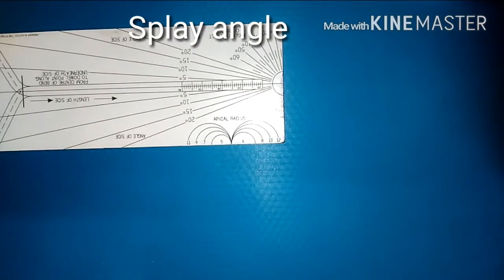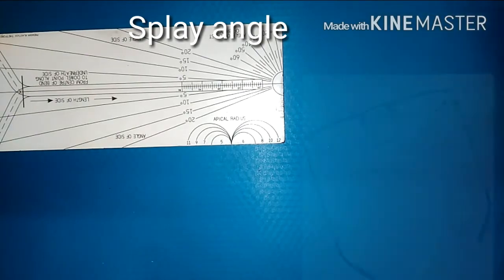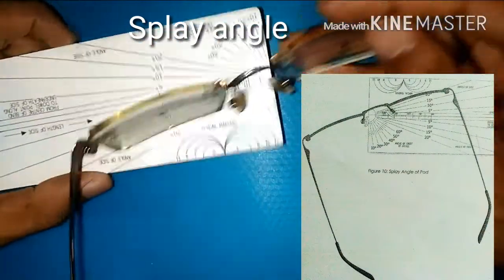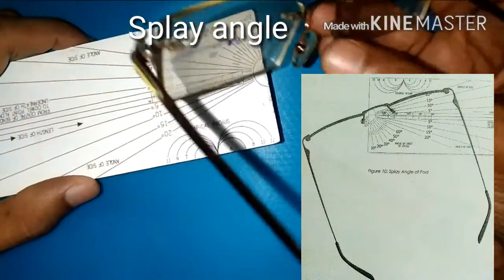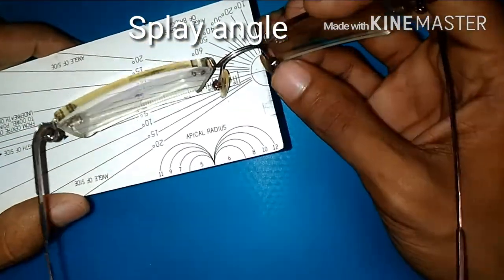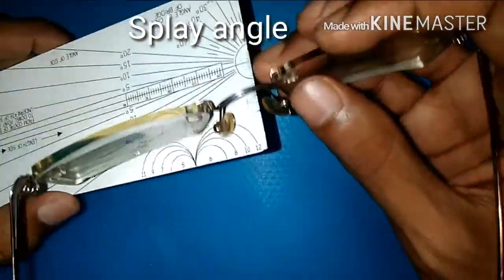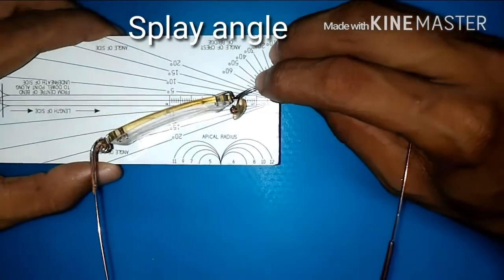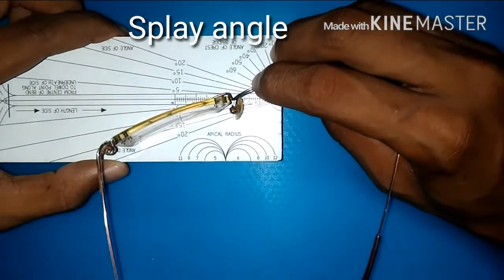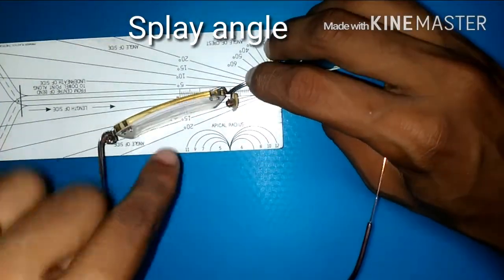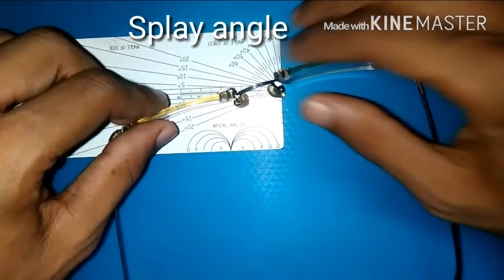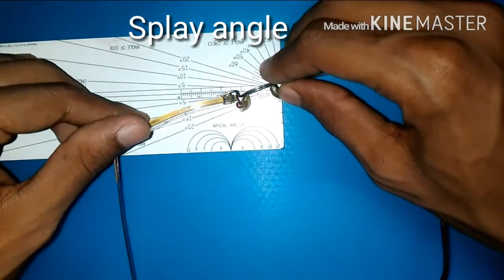The splay angle is the angle between the pad plane and the normal to the back plane. To measure that, place the surface of the pads along the sides of the scale and then try to measure the maximum angle from the inner sides. For this it is around 15 degrees.